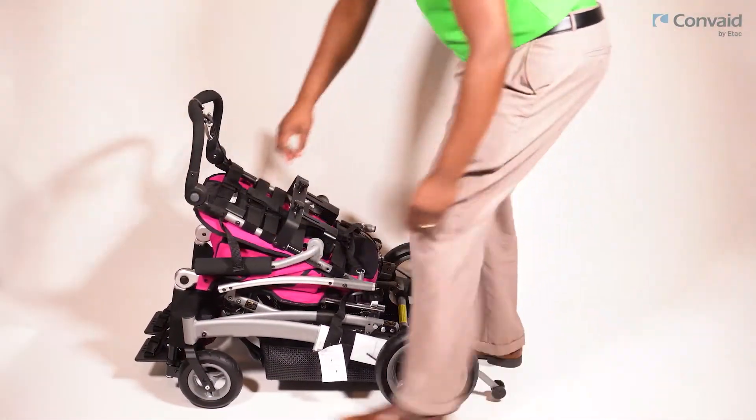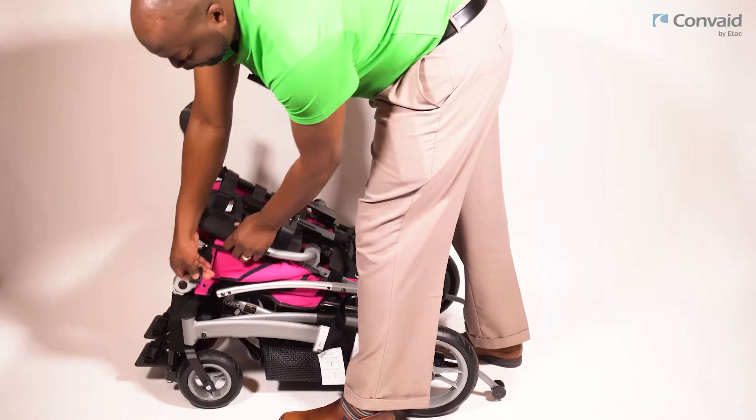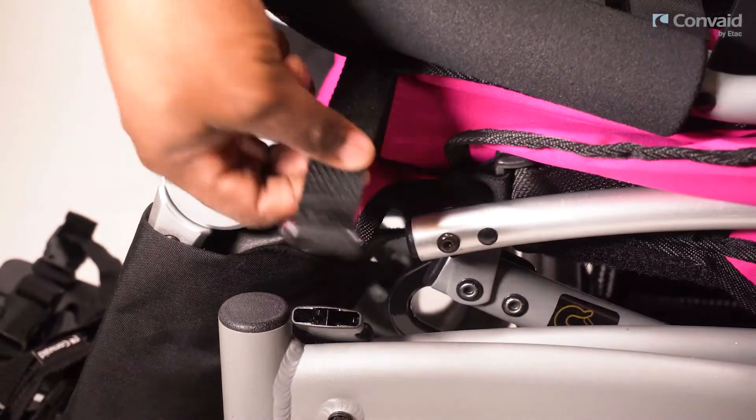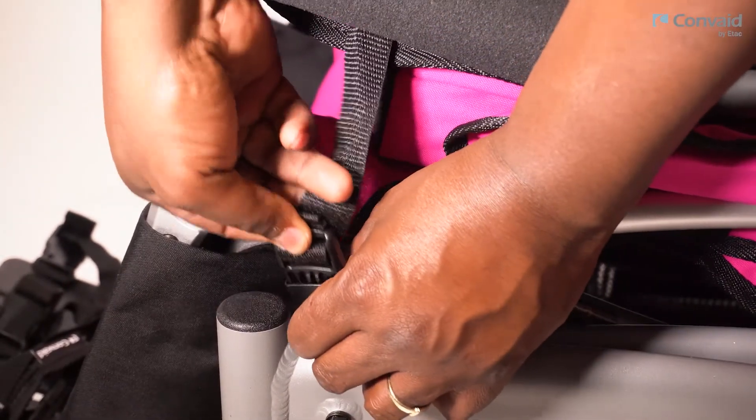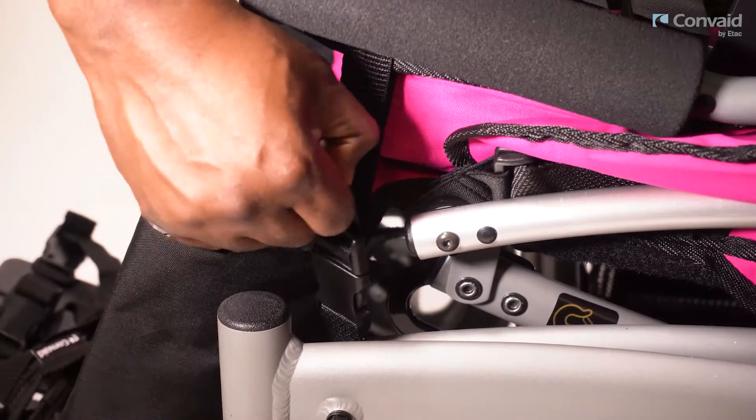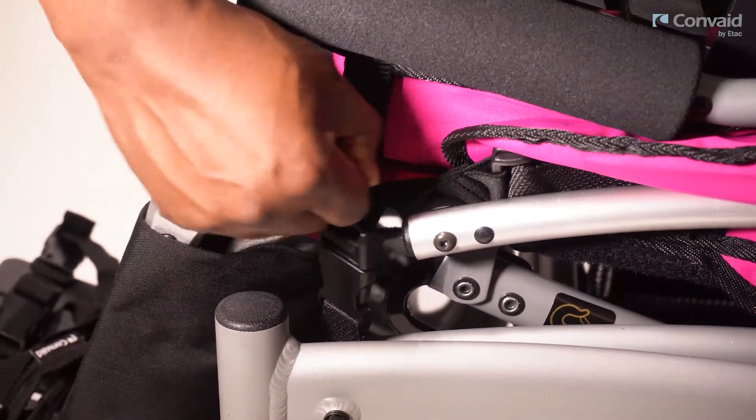Disengaging the backrest allows the frame to be folded. The next step is to locate the securement strap on the side of the frame to ensure the frame does not unintentionally unfold.